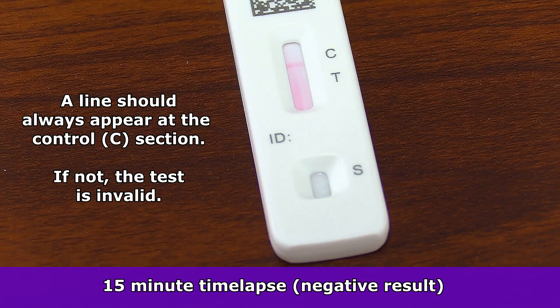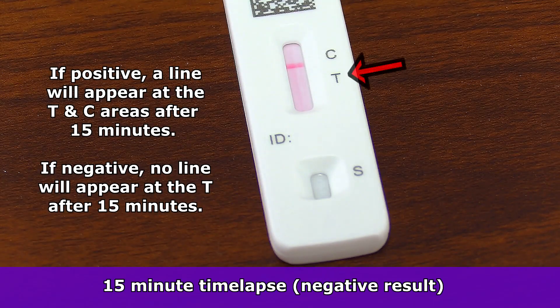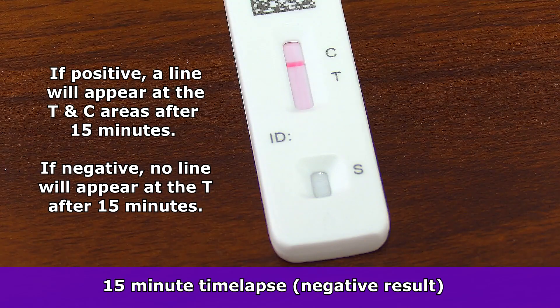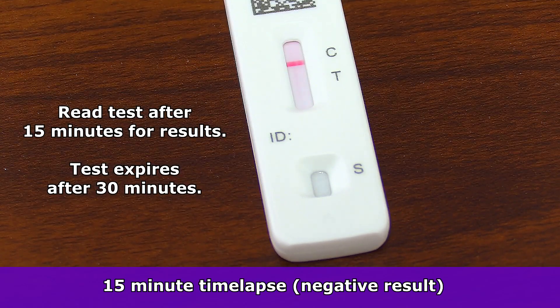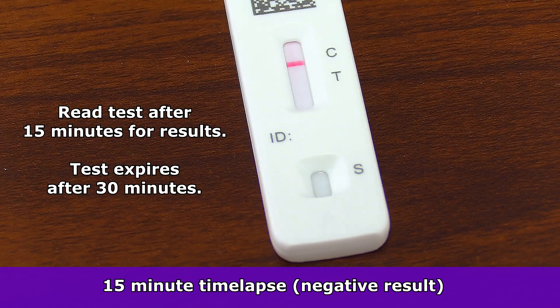Now we're looking for a line at the T part, which is the actual test part. If a line pops up here, that means it's positive. But we need to wait 15 minutes to see what the results are. And if after 15 minutes no line appears here, the test is negative. One thing to note with this test: the results are not valid after 30 minutes.